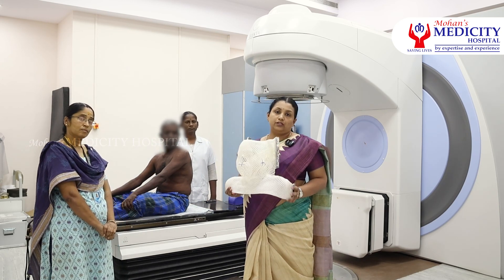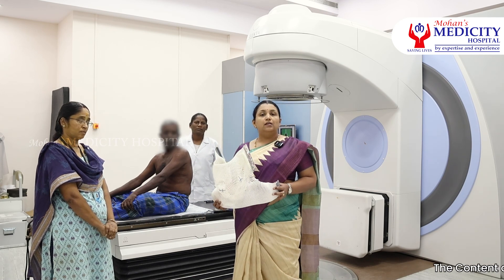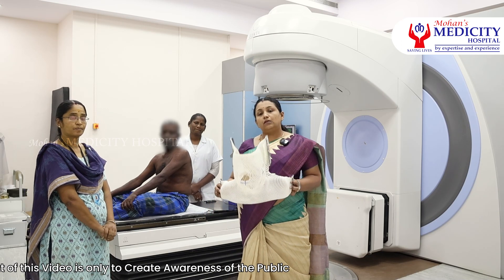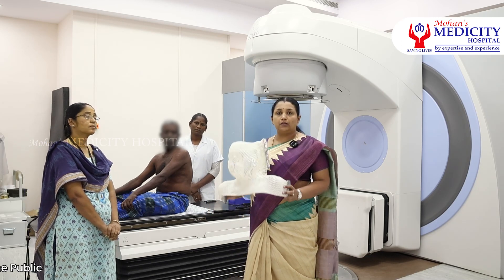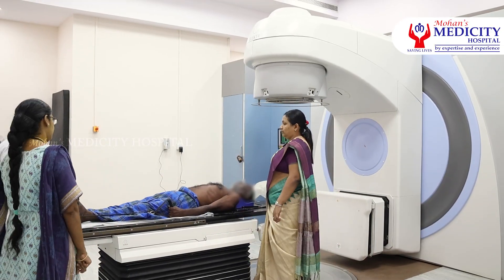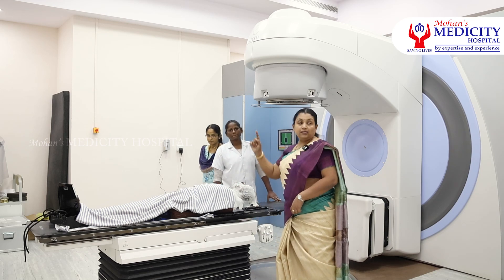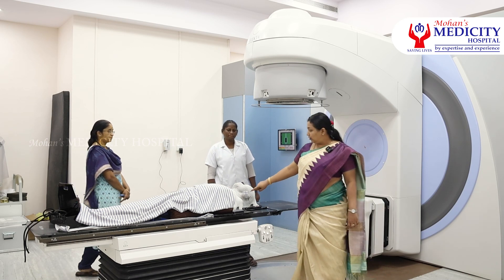There is an immobilization device ready. This is a molding. For example, this patient — it is a case of carcinoma of the retromolar trigon, that is, the oral cavity. We will define it in the treatment mode. When the patient is positioned, we will proceed.